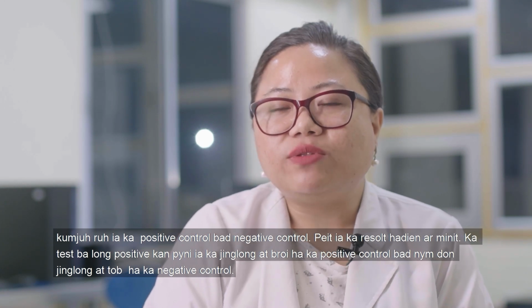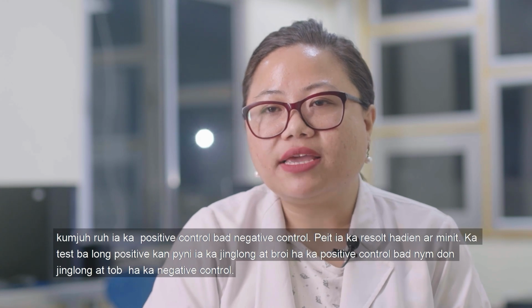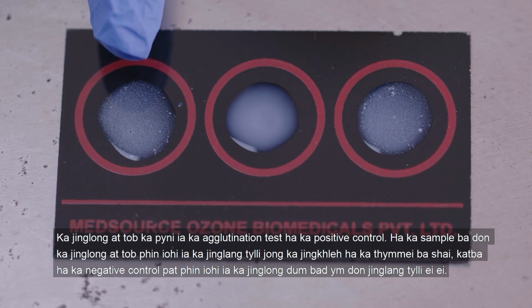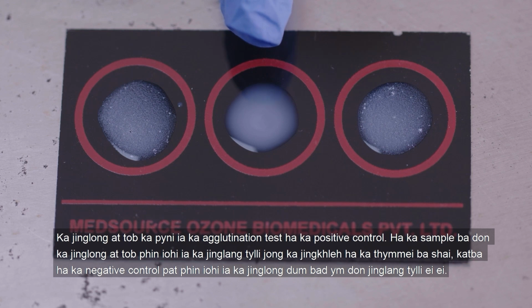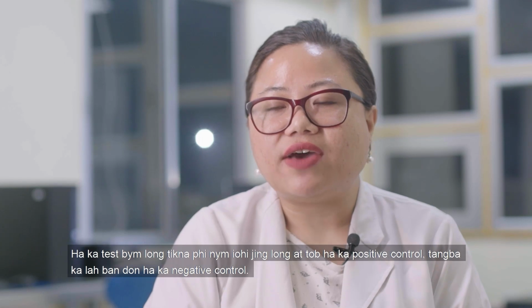A valid test will be seen as clumping in the positive control and no clumping in the negative control. Clumping signifies an agglutination test. In a positive control where clumping occurs, you will see visible clumps with a clear background, whereas in a negative control, there will be a cloudy appearance with no clumping. This signifies a valid test.